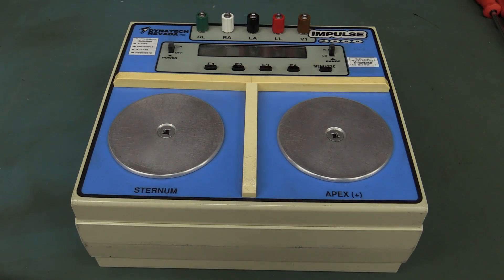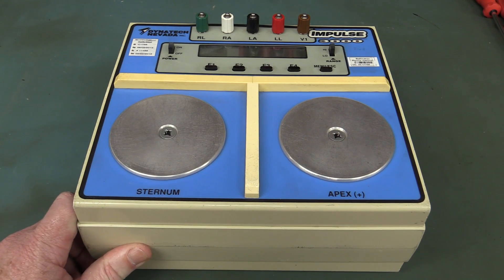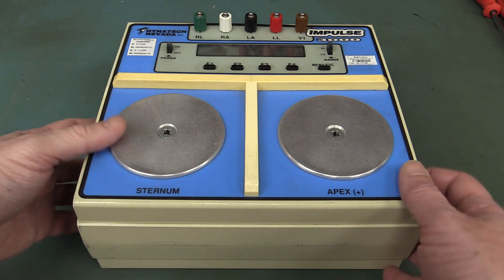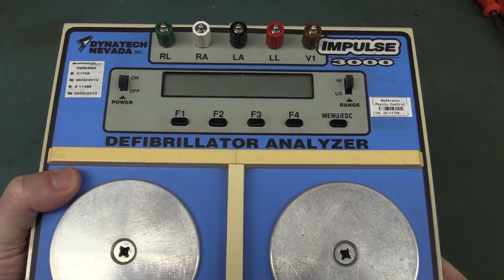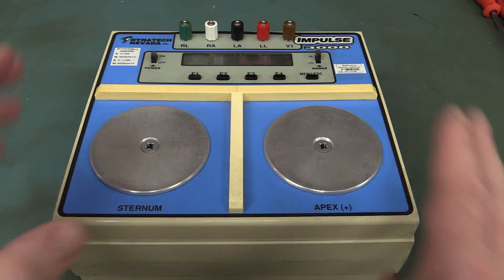Hi, welcome to a mystery teardown. Thank you very much to Eli Kamensky for sending this one in. He's from Washington in the USA, and what it is, is a defibrillator analyzer for analyzing defibrillators. Specialized bit of kit.